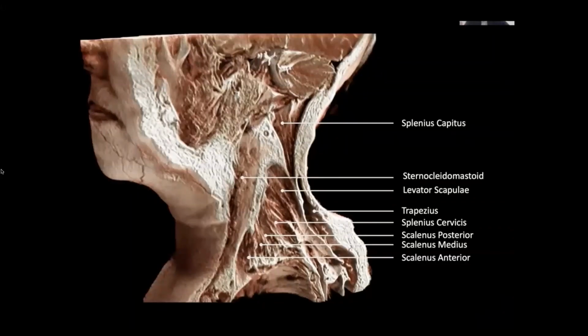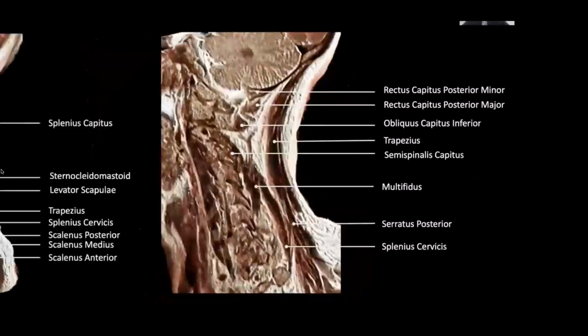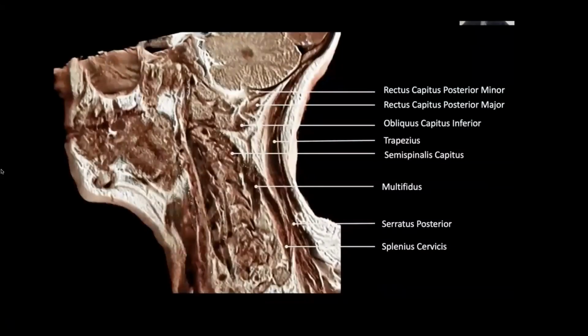So you go from the 3D to the CT or the MR, and then to the plain film, which is kind of the opposite of what everyone learns, because the plain film is actually the most hard to understand, because it's the one most furthest away from reality, right? So you learn something in anatomy class in a 3D perceptual holistic environment, and then you kind of work your way back to cross-sectional imaging, and then work back from cross-sectional imaging to composite imaging like ultrasound or X-ray.